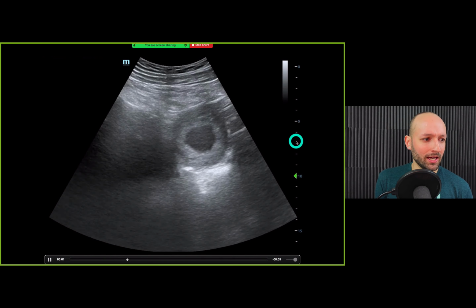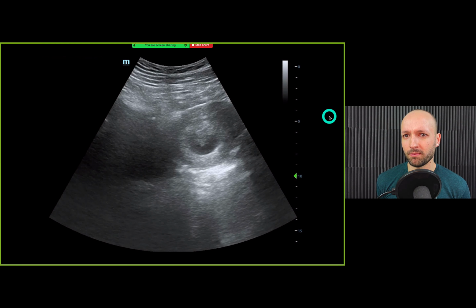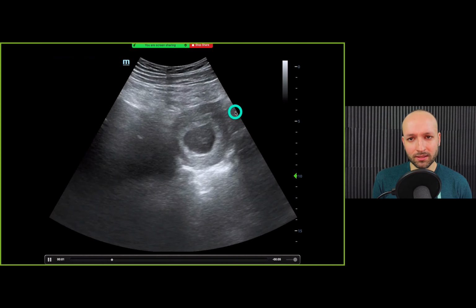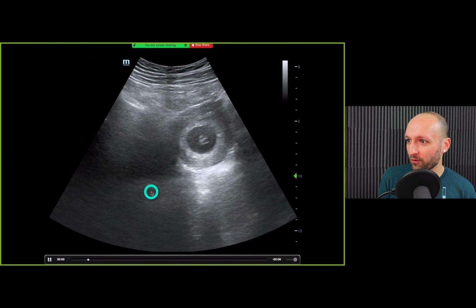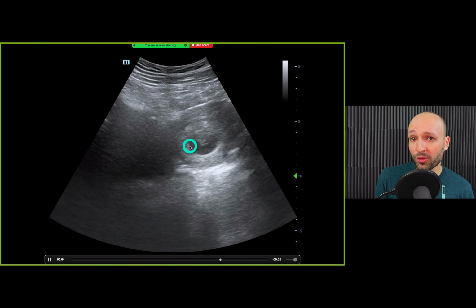Here is a clip that we actually did. I think it was maybe a month, maybe a few weeks ago. Now, we're seeing this, and let's assume that this was definitely in the uterus, because it is. That's not the point of this next section. It's really difficult for me to see the gestational sac, right? There's a couple things you can do to fix this.